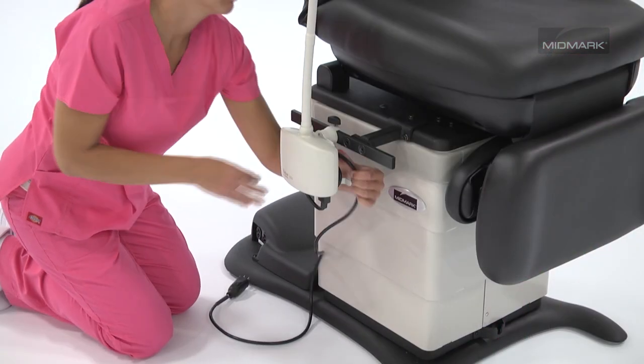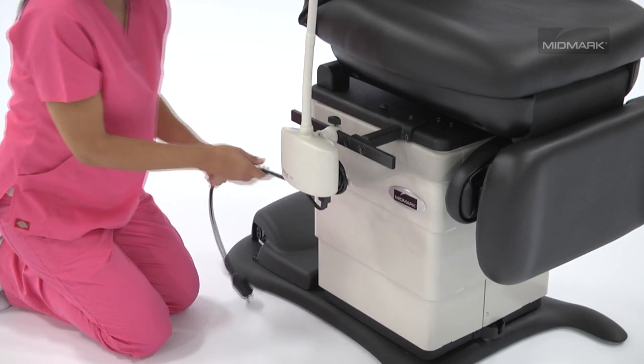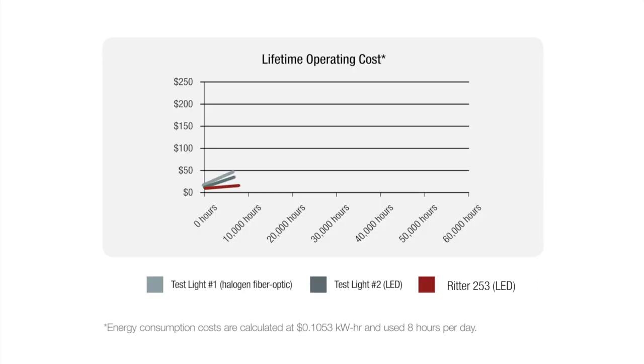The table mount can help eliminate trip hazards by keeping cords off the floor and contained. Simply wrap the extra cord around the built-in cord restraint and plug directly into the table.